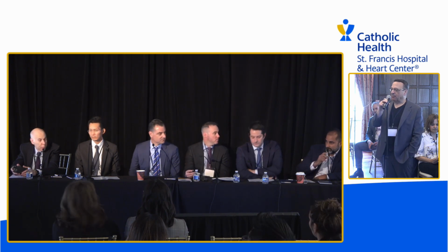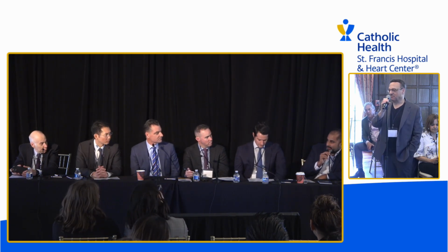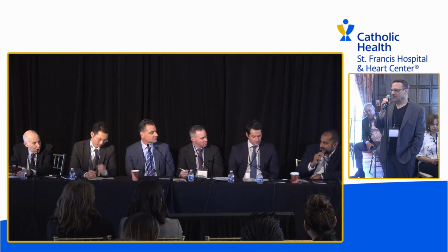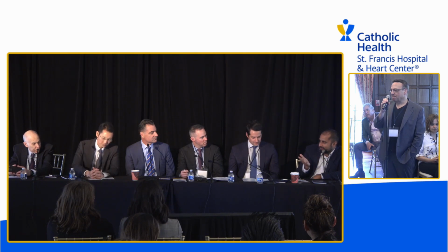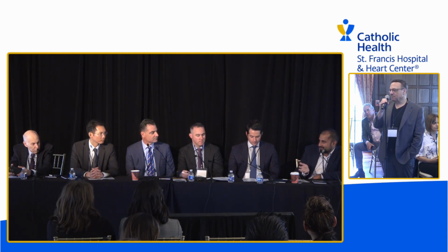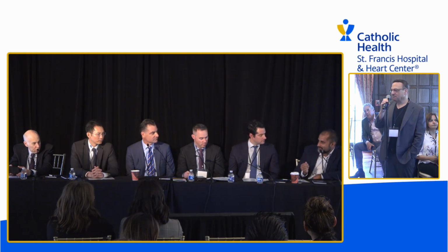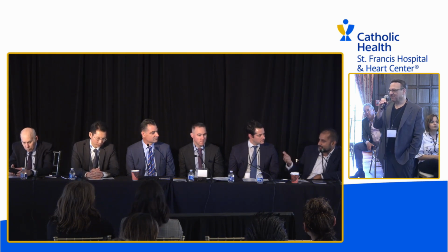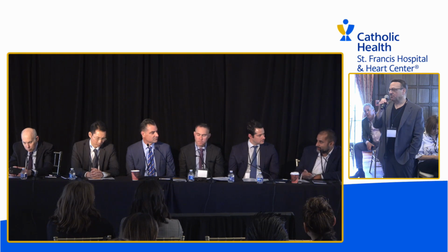Omar, do you have any thoughts about the MR improving? Yeah, we didn't see the echo images, but it said eccentric jet, which could mean functional or degenerative. Similarly to surgery, we have TAVR data saying that functional MR likely gets better, but degenerative doesn't. So that's something you could assess later. Al and I have had discussions in the OR when he's doing an AVR of a combined strategy. For example, if he thinks the risk of an additional mitral surgery is high, even in a youngish patient, we're calling 70 young, that patient could then be reevaluated later for a potential mitral clip.